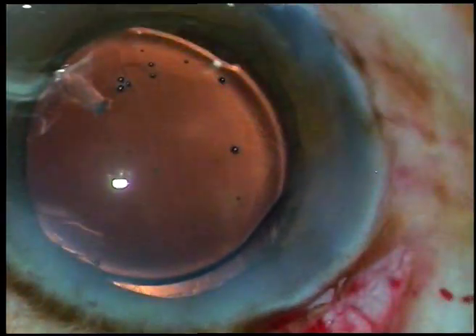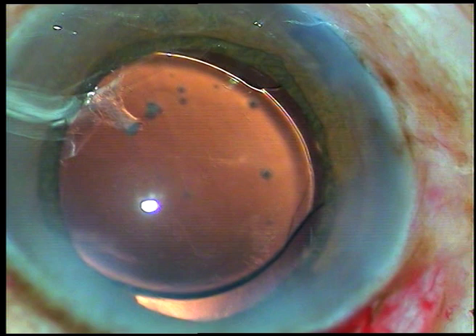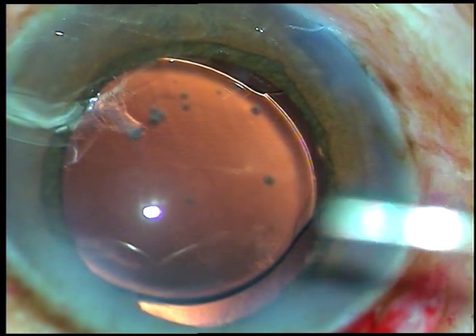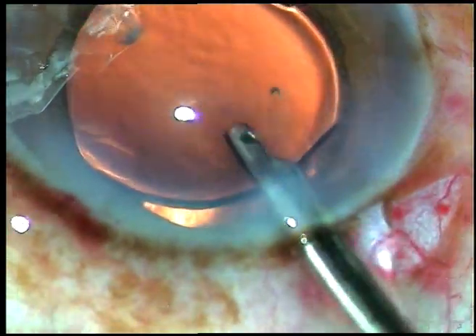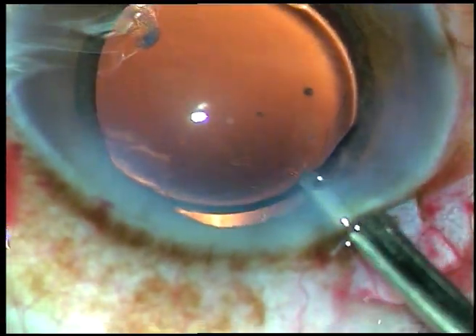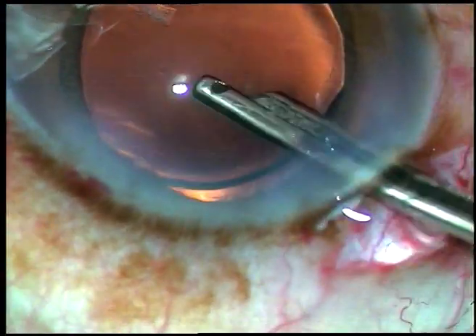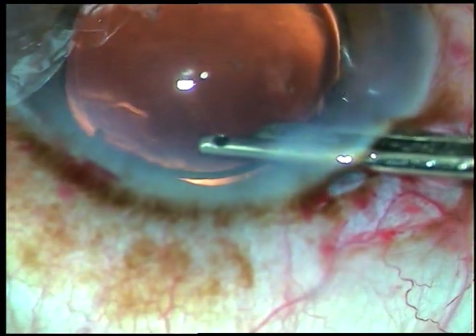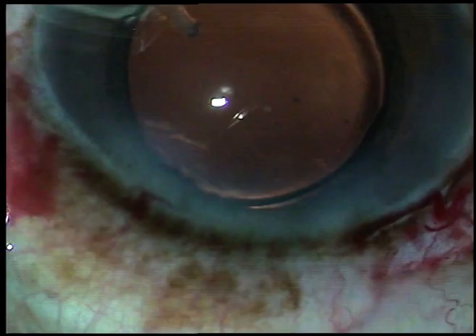This is a hydrophilic acrylic intraocular lens. I hydrate the sideports and do the final lavage. Thank you very much for watching. I hope this video will help you in developing your surgical skills.